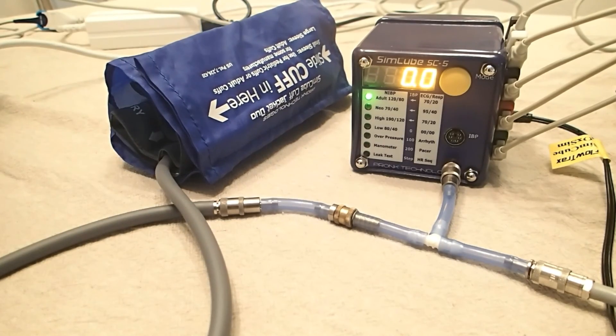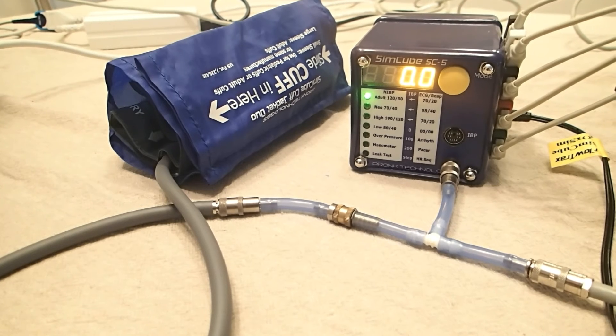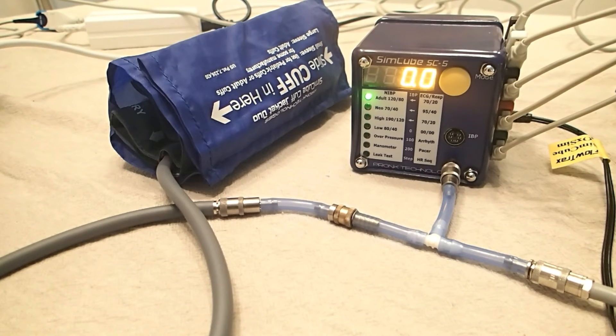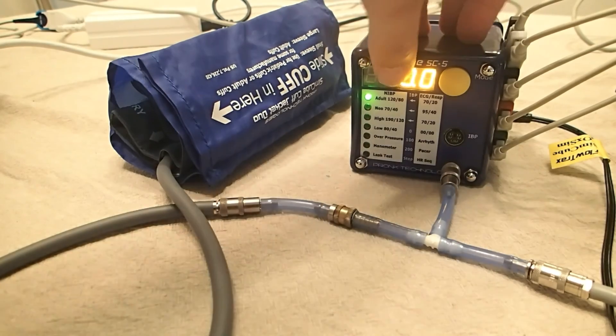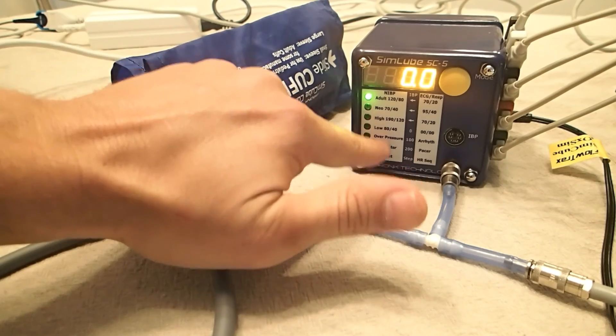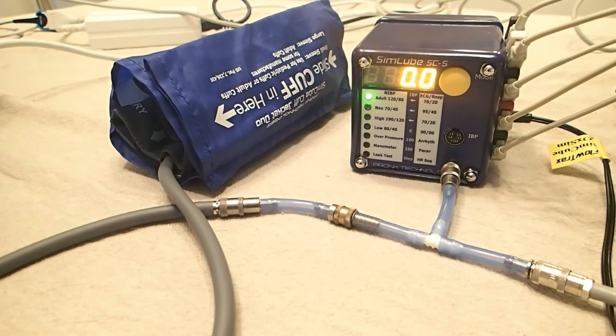Now everything's set up. Whenever we're ready to run our non-invasive blood pressure measurement from the device, we want to make sure we've set this up correctly here and chosen the NIBP measurements that we're looking for. We're going to leave it at adult 120 over 80 right now.